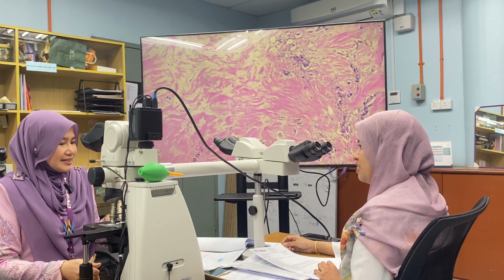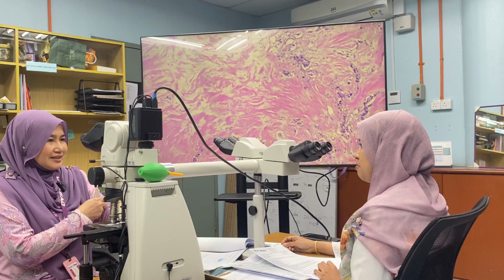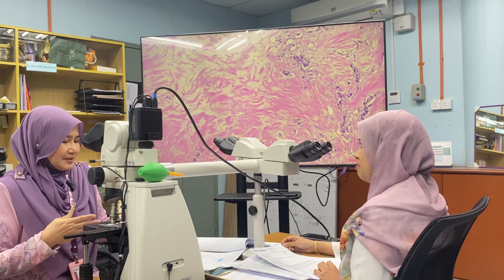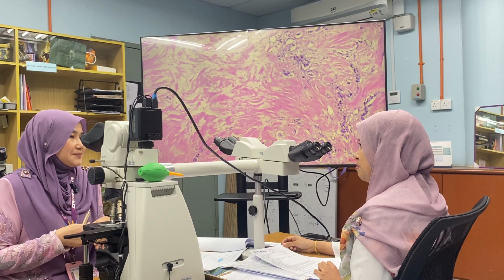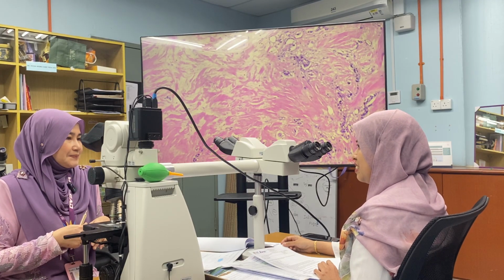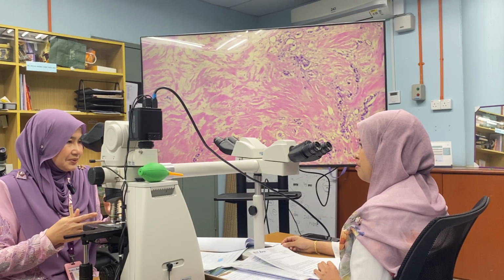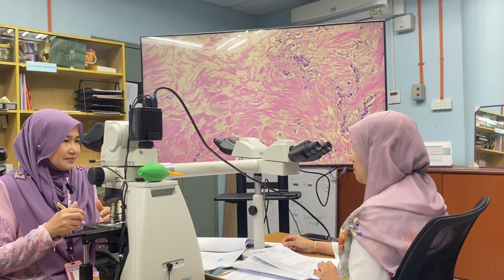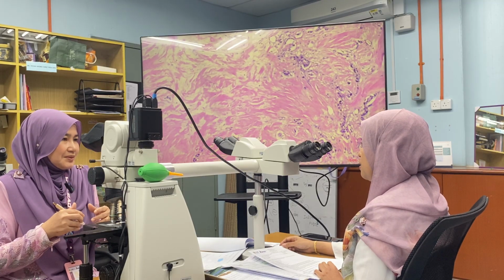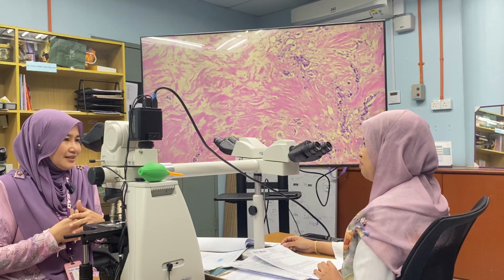While examining the lymph node, do you assess all the chemo changes, the pathologic appearance post chemo, in the lymph node? In this case, yes. And then when you detect any changes, what do you need to do? You need to describe it in your description. All right.